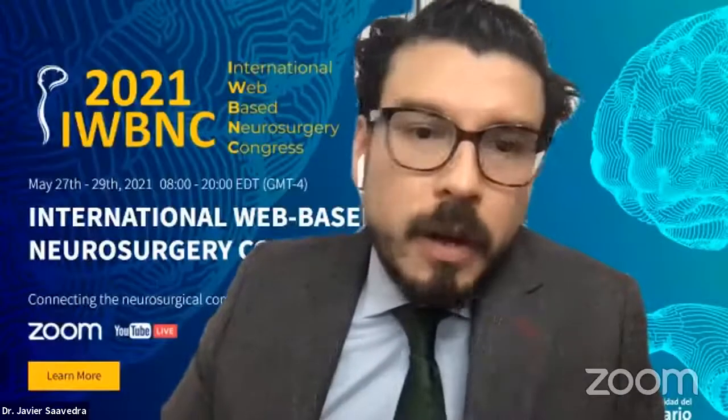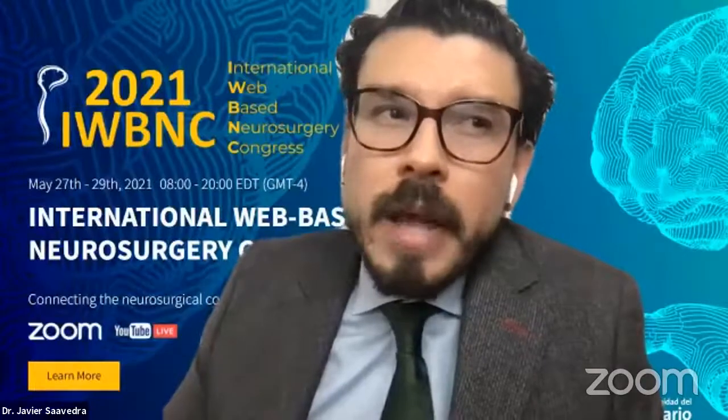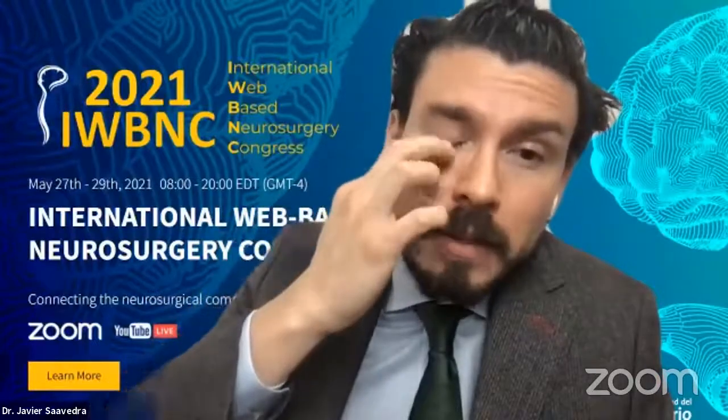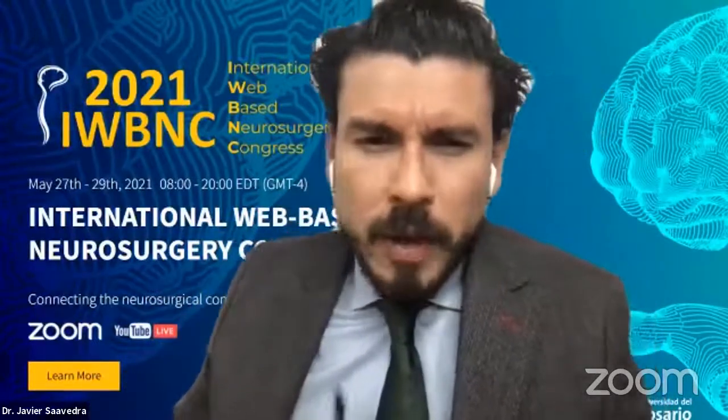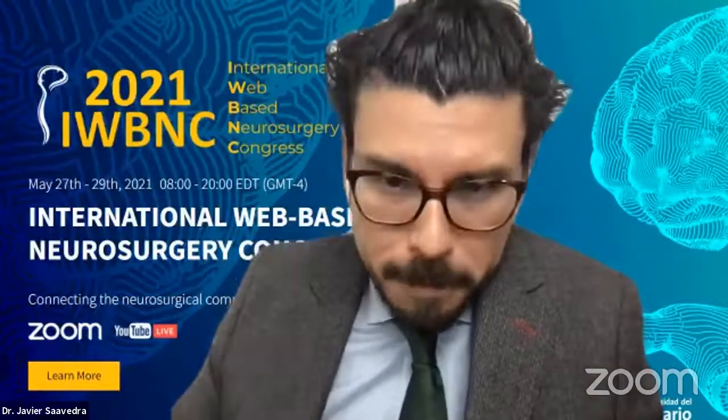Patricia Suarez is asking, what is the indication for the use of isotonic solutions in continuous irrigation, like Ringer's lactate, during the endoscopic technique? Yeah, we do it regularly. We do it all the time. We usually use saline solution, and you have to do it all the time, especially when you're drilling. And what we do now is we have some sutures on the eyelid to keep it closed during the procedure, so we don't have to be irrigating the eye globe, but yeah, we do it regularly.